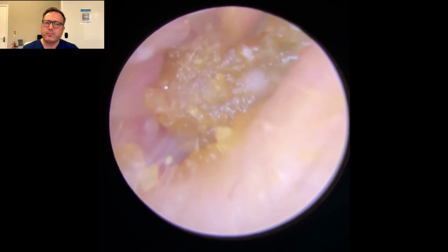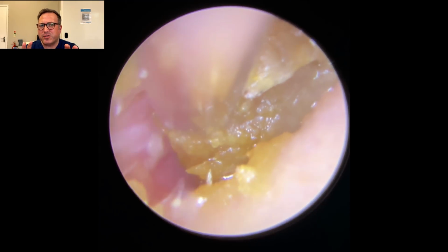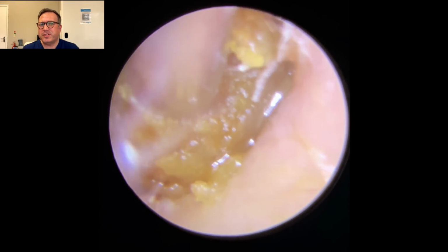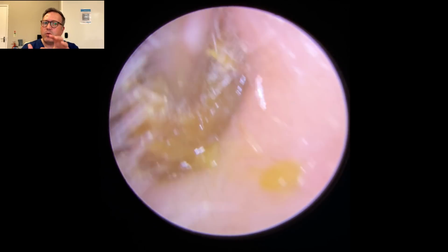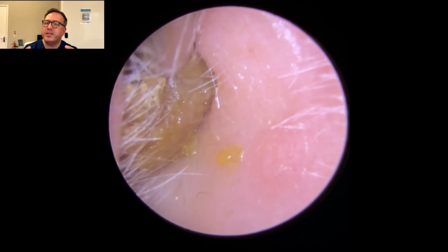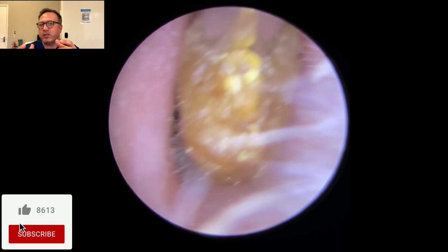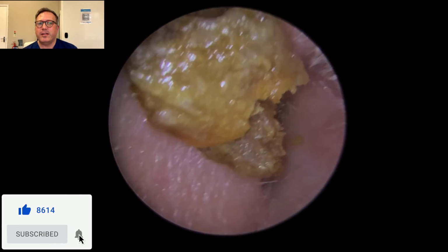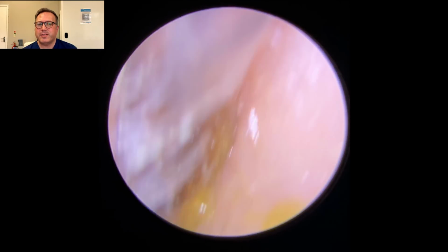It also coats the canal wall, so it helps the wax to slide out of the ear a little bit more easily. We're just working this wax and detaching it from the canal walls at the moment, just working this down the canal. You can see it's coming down nicely. Because it's got that softer layer to the outside, we can get a good grip, but the central section of wax is not broken down completely, which means that central portion of wax has stayed quite solid. So the whole thing is starting to move down the canal a lot more efficiently. There we are, you can see that's coming away nicely. There's a little bit left behind it, so we'll go and grab that section.